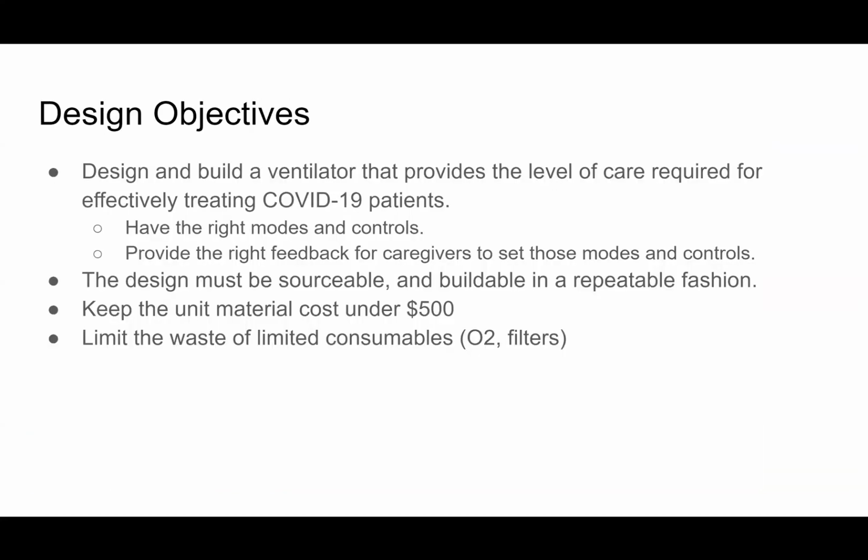So our overall design objective is to design and build a ventilator that provides the level of care required for effectively treating COVID-19 patients. There are a lot of projects out there that aim to inflate a bag or make a test lung move, and we're trying to be a bit more focused. With all our doctors and reviews of the papers, we're trying to make sure that we have the right modes and controls specifically for the type of treatment that ARDS COVID-19 patients will need to make it all the way from disease to recovery.